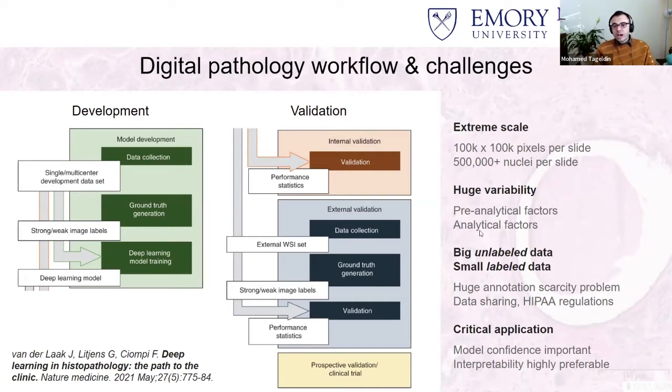You have a data problem, which is kind of also unique to computational pathology, in the sense that we have a lot of data that is unlabeled, but we don't have a lot of labels in pathology. So whenever people talk about big data, there is somewhat of people conflating the two with each other, at least in the media, right? Big data implies that we have everything we need to train models, but in computational pathology, we really mostly have unlabeled data, just the slides themselves, which is useful for some weak annotation paradigms that I don't work with. But if you want to do the full supervised machine learning, which uses the data as well as the labels, that is really a big problem in computational pathology in terms of data availability, at least public data availability.